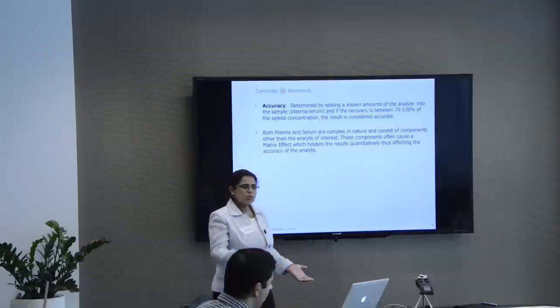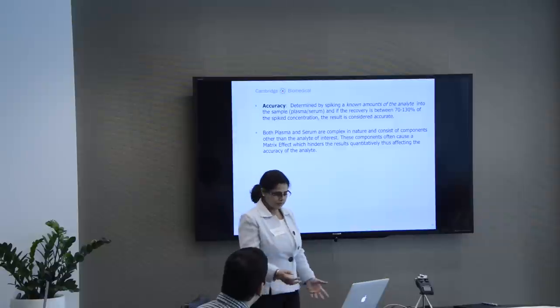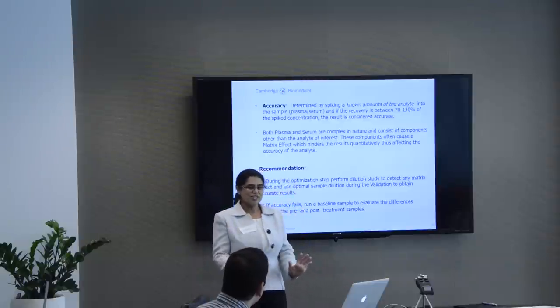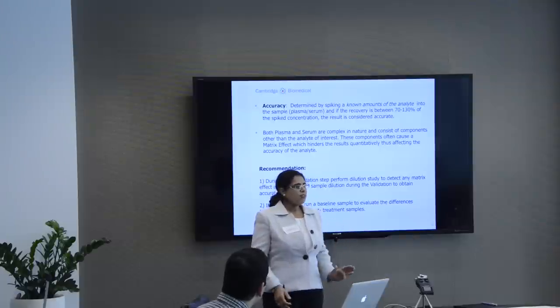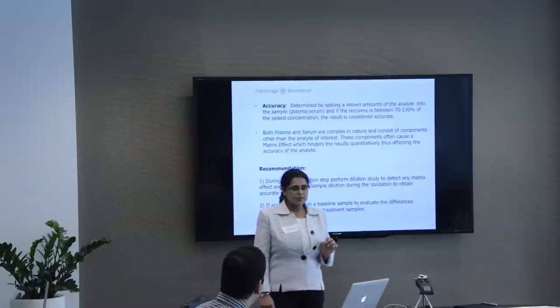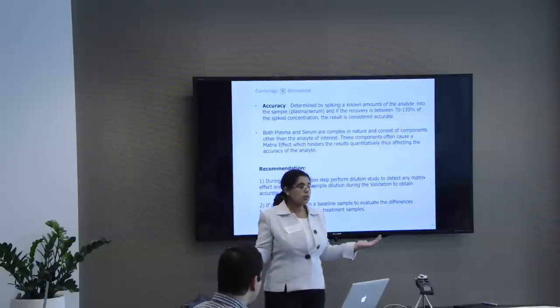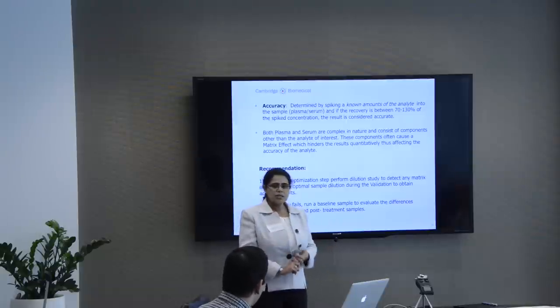So we just talked about matrix effect. It's there. Can you get rid of it? Yeah, you can, by diluting the plasma samples. Does it always work? No. You know what? Again, think about it. There are 15 different cytokines. 5 of them are going to work at a dilution of 1 to 2 and give you that accurate result. Another 5 are going to work at a dilution of 1 to 5. Some you dilute, you lose the signal because they are so low. They are so close to the lower limit of quantitation. You cannot dilute them. So are you going to run the patient samples at three different dilutions?